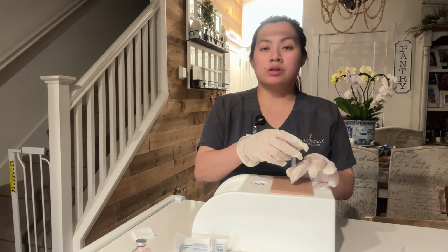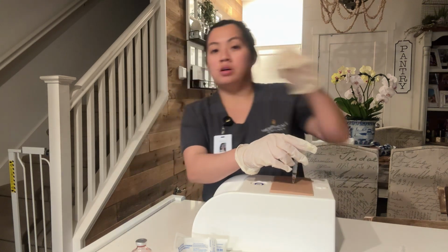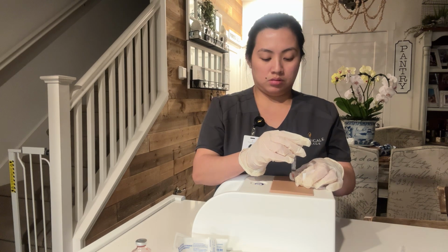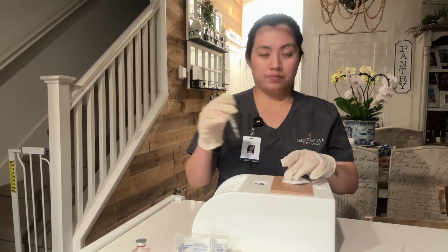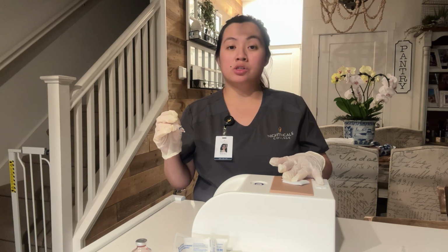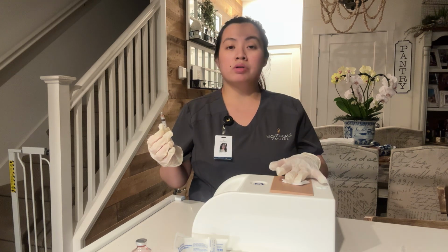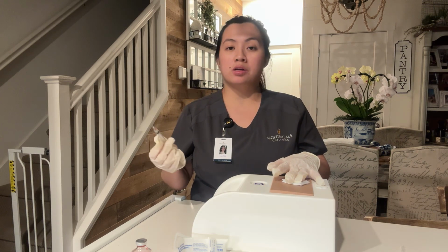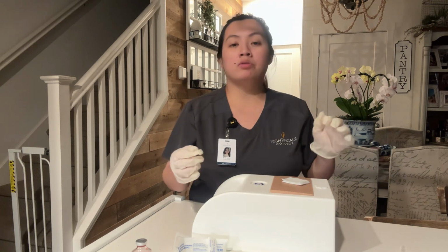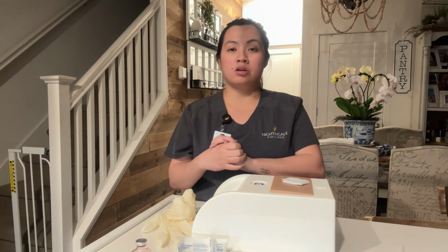Okay, so now we're gonna withdraw the needle quickly while gently placing the gauze over the site. Okay, and then avoid massaging the area and apply a bandage if necessary. And then we're going to dispose of the needle and the syringe into a sharps container without recapping it. Okay, and then we're going to remove our gloves, perform hand hygiene, and I'm going to document the procedure.